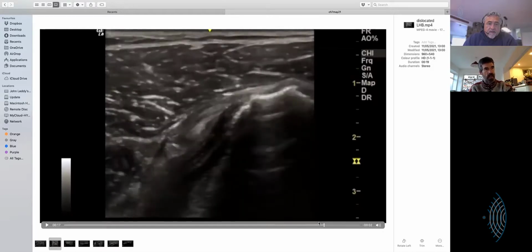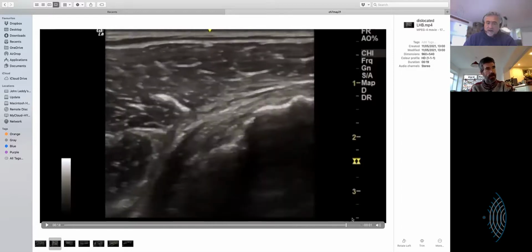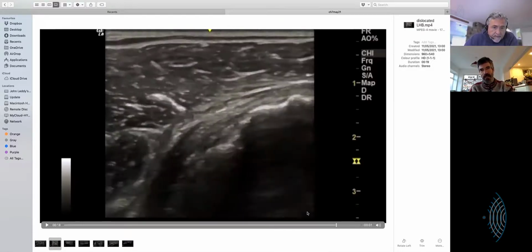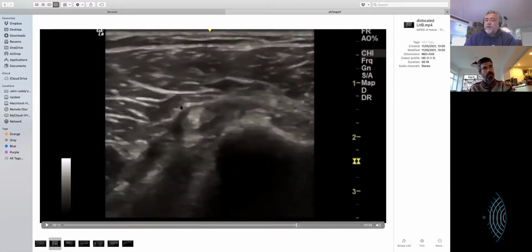So he's coming over the classic lower fibers of subscapularis that are more meat, less tendon. Yes. When you get past there, you don't really see very much tendon. It's straight up that biceps. If you follow it, it's straight onto the bone, which is shouting out at you that the subscap is torn. The bone is, or the dimension is, or the fact that you don't see. You've got subscap, long-headed biceps here. Yes. You're always going to be suspicious because it's dislocated.